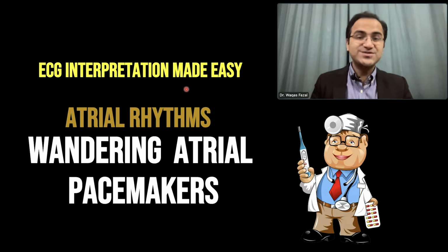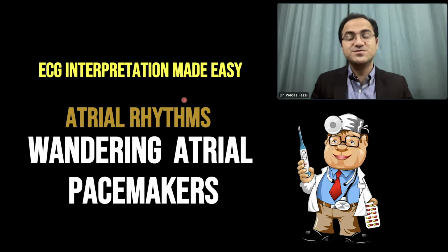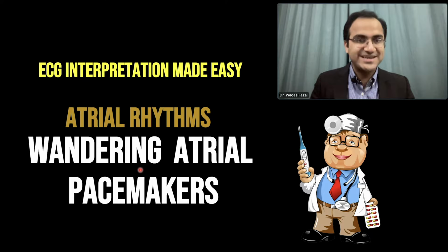Okay, in our video series of ECG interpretation made easy, in this video we are going to talk about two atrial rhythms. We are going to talk about wandering atrial pacemaker and multifocal atrial tachycardia.